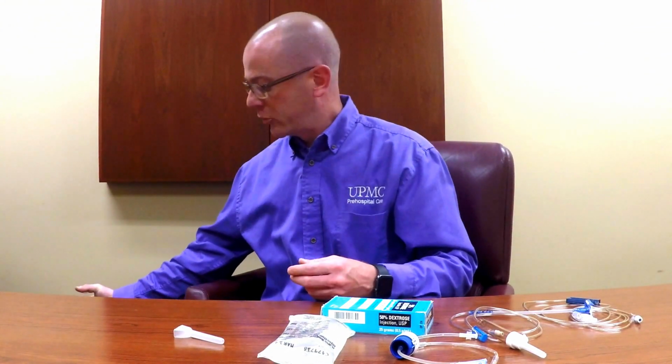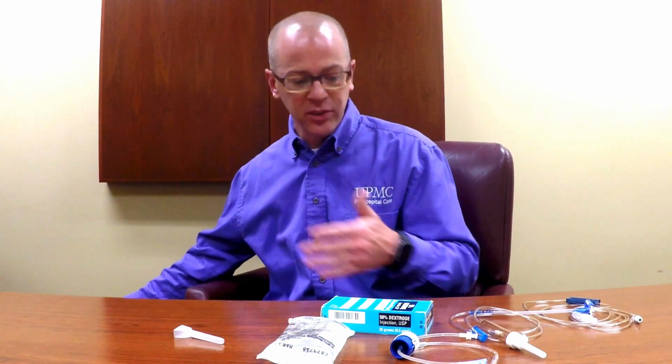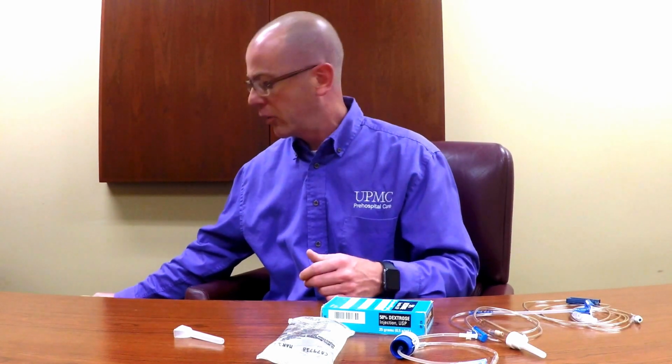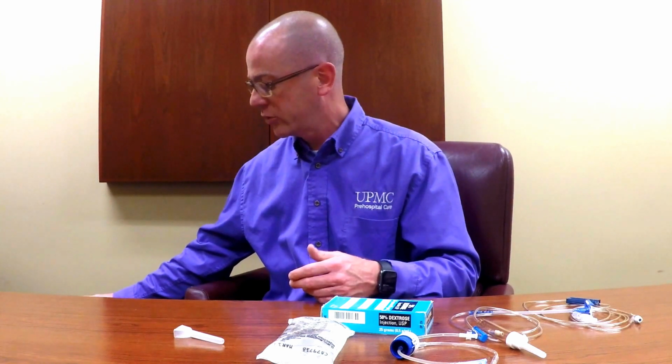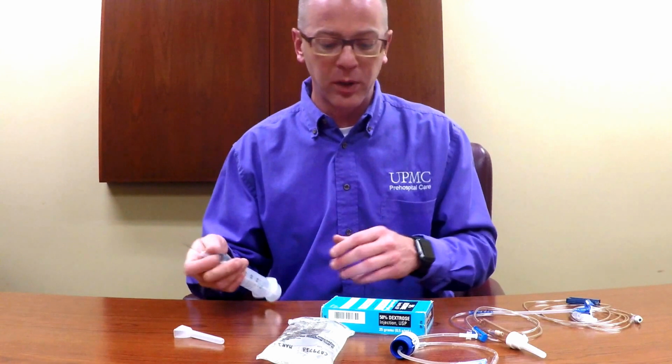And of course, for demonstration purposes, I'm taking a lapse on cleaning ports with alcohol or even taking appropriate aseptic technique. But this is to demonstrate the process of preparation, dosing and administration, and is not meant to be 100% clinically accurate with how we would expect you to perform in the field.